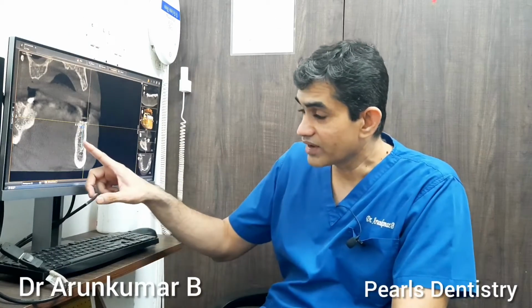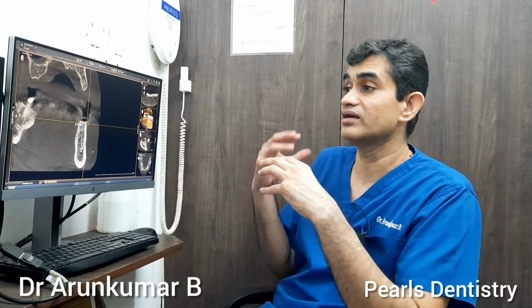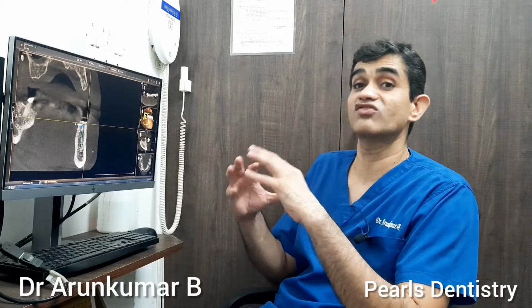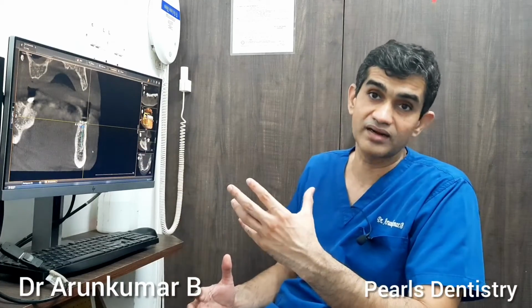We can also evaluate the quality of bone, how dense the bone is. It will also help us pick up any infection that is there. The importance of a CT scan is to give us three-dimensionally accurate information to plan that implant. We can measure bone in terms of volume, the height of the bone, the width of the bone, and also the quality of the bone. So that's the importance of CT. I would definitely prefer to do a CBCT before we plan an implant.